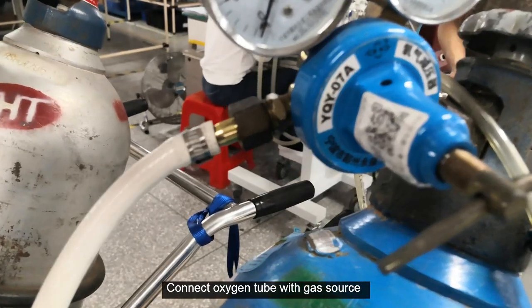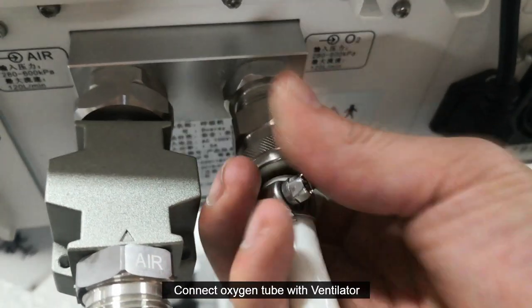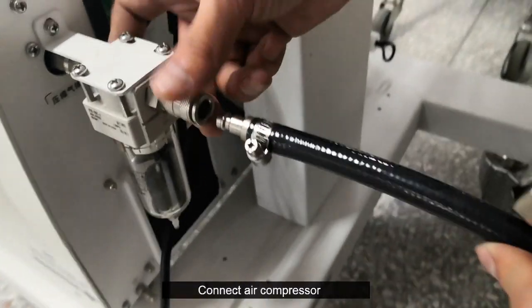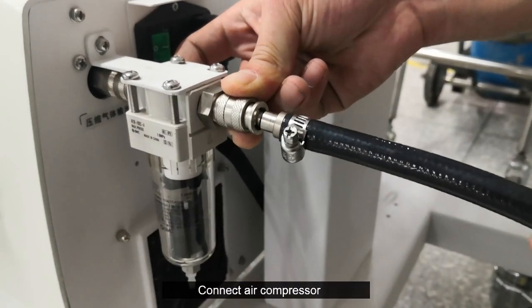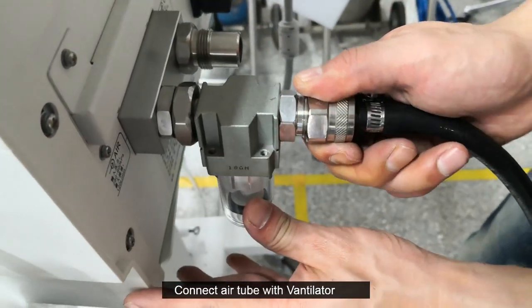Connect the oxygen tube with the gas source, then connect the oxygen tube with the ventilator. Connect the air compressor and connect the air tube with the ventilator.